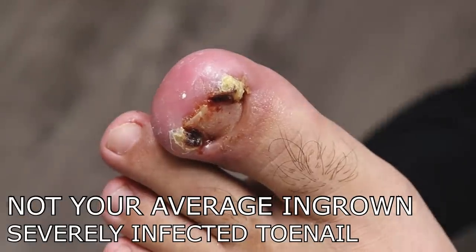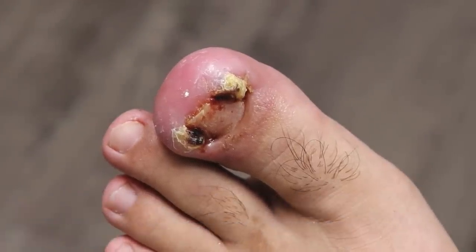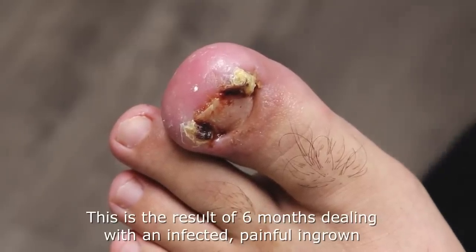Small pinch on either side. Plus if you've been walking around with that, you're a tough guy. Most people — you're tough to be walking around with that and a little crazy.